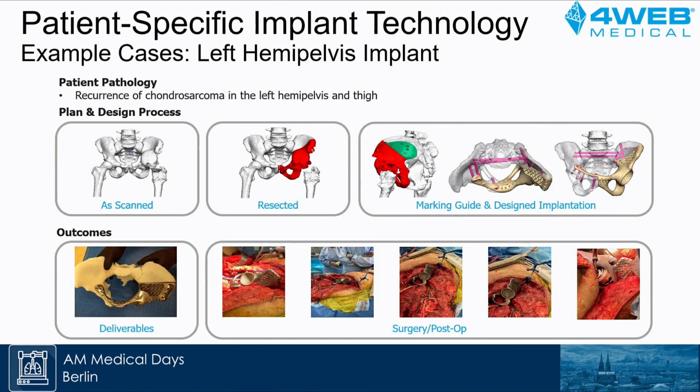It's a structure, so the limitation is we can't really have this entire volume very solid. You want to have a lattice for the light weighting, otherwise it's going to be very heavy. And also you need some features which allow this device to be attached to the bone very well, and it gives a very good fixation. So again, this case was designed.